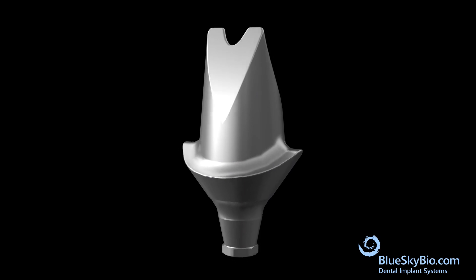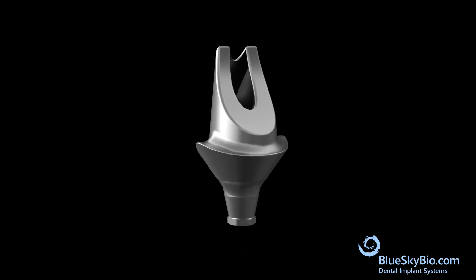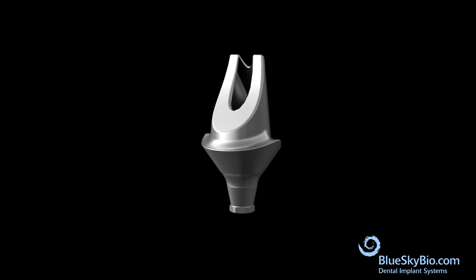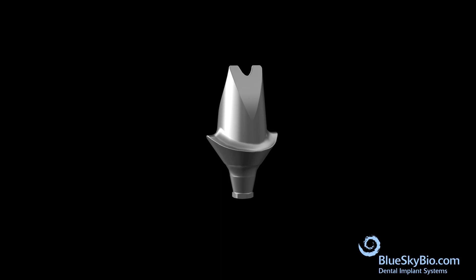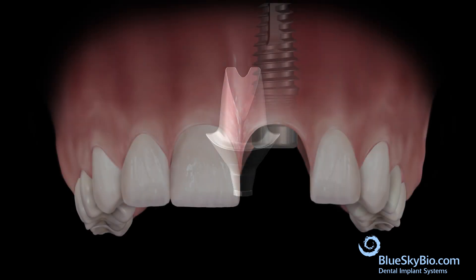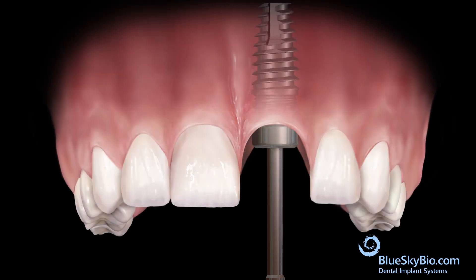This video shows how to make a custom abutment from a preformed blank. After the implant is adequately integrated, remove the healing abutment.